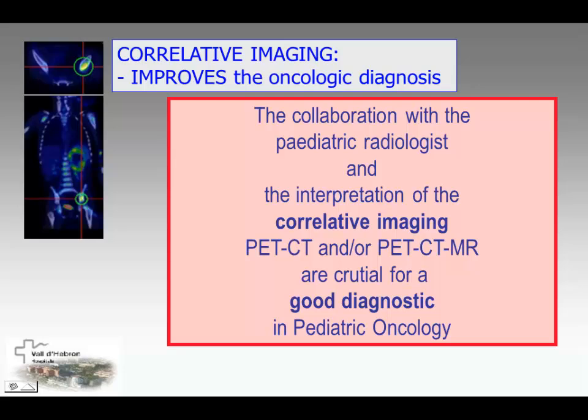Thank you. If you allow me, I have another question for the first lecture. Which radiological imaging modality do you prefer in a pregnant woman in the first trimester who should be diagnosed with a bone problem? Well, it's an immensely tricky question. If you can do it with MRI, you should. It is something that we see very rarely, and we discuss very intensively. Having said that, you can do bone scintigraphy if you take some precautions, but obviously MRI is preferred.